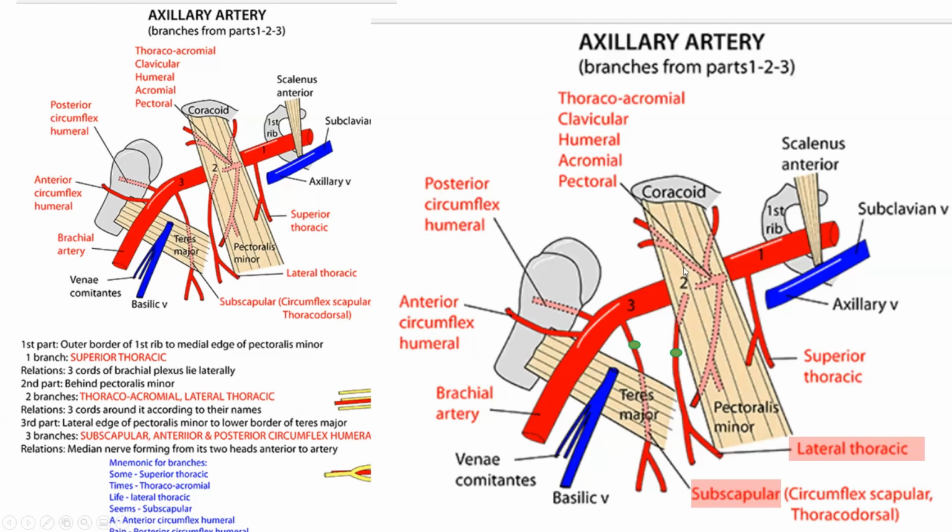So we want to stick the second, A2 segment of the axillary artery. And we aim by angio guidance to the segment between those two arteries closer to the lateral thoracic artery, which will get us into A2 and away from the brachial plexus. We want to avoid A3 because it overlaps with the brachial plexus, the cords of the brachial plexus. We want to avoid A1.